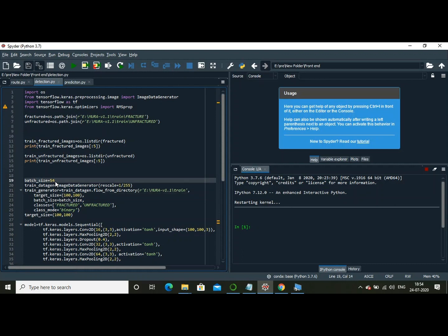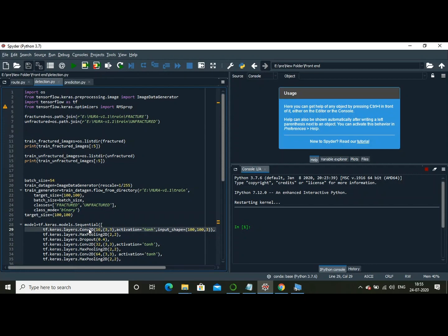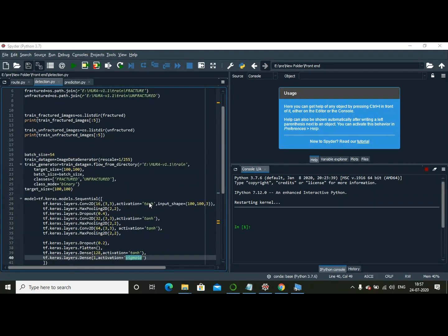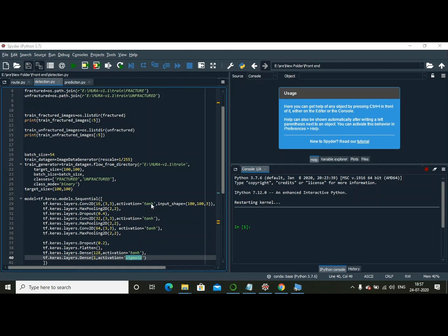After that, I have used the Conv2D filter from the Keras module and I have applied the tanh activation function, which would be more appropriate than the ReLU function because it has more gradient advantage when compared to the ReLU function. Soon after that, I have used the max pooling 2D function and I also considered the dropout in order to avoid overfitting.